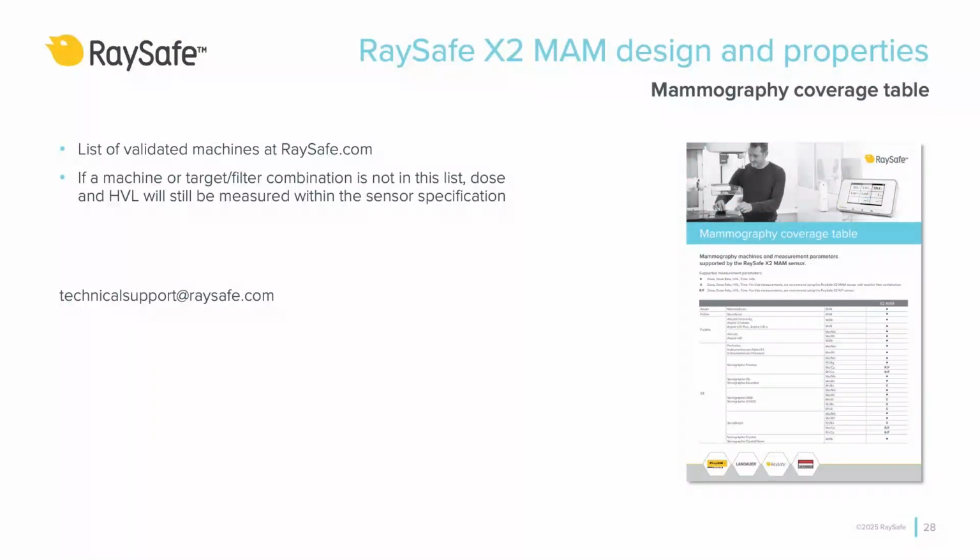On the raysafe.com website, you find the list of all validated machines for RaySafe MAM sensors. It is named Mammography Coverage Table. If you have additional questions regarding measurements, you are more than welcome to contact our technical support.